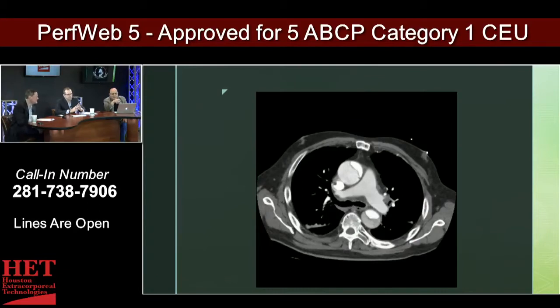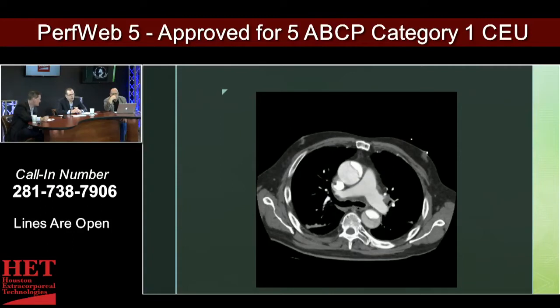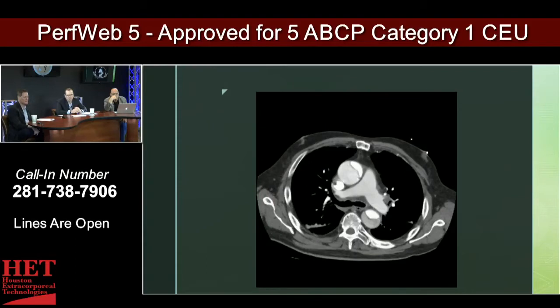This is an aortic dissection involving not only the ascending aorta but also the descending aorta — so this would be a type one dissection. The wider area in general is going to be the true lumen, and the one that's got less contrast, a little more heterogeneous, is usually the false lumen because it's mixing. You have some stagnant blood and also contrast mixing in there, so it's a little more heterogeneous. It's not uncommon for the false lumen to be bigger than the true lumen.